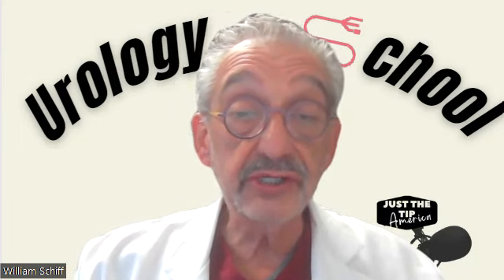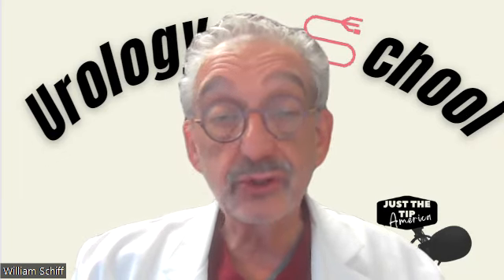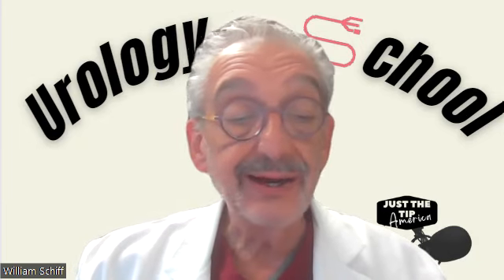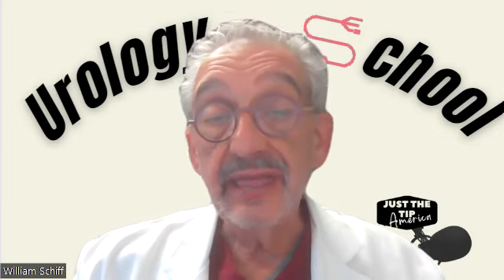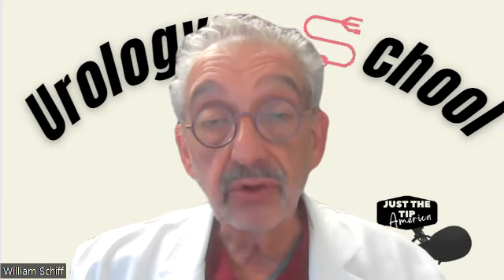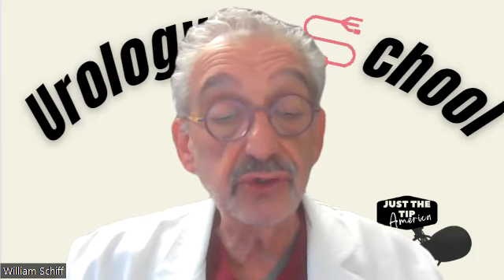Today we're going to discuss MRI, a great diagnostic tool in urology. Fluid in the collecting system is very bright on T2 weighted imagery, and that allows us to look at a variety of urologic issues.